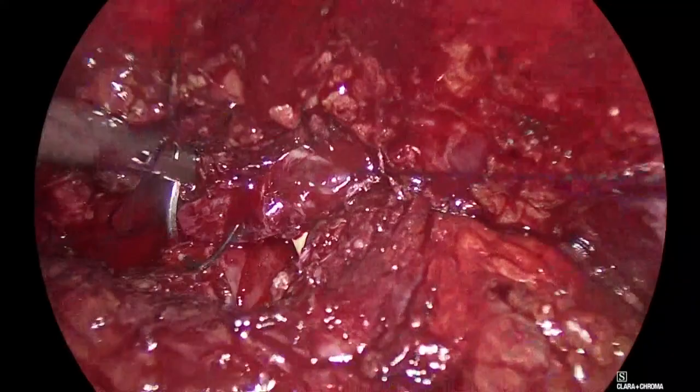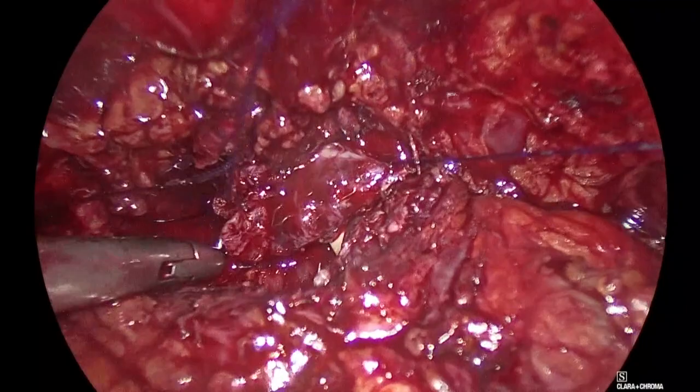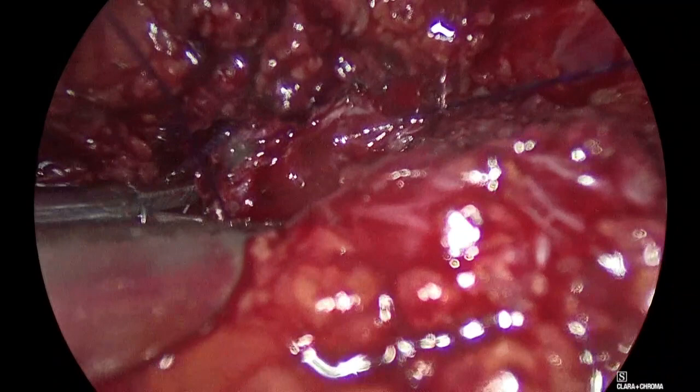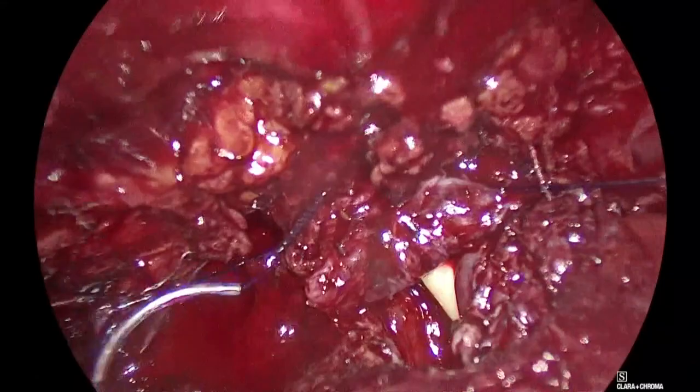Do you plan a lymphadenectomy in this patient? No. For two reasons. First, I was not asked to do it. And second, if you do a lymphadenectomy with this mess they have in there, it's a disaster. Fair enough. If you were to do a lymphadenectomy, do you do it before the anastomosis? Yes, after the prostatectomy, before the anastomosis.